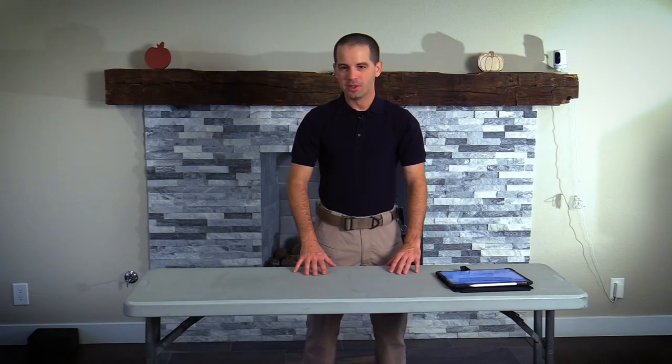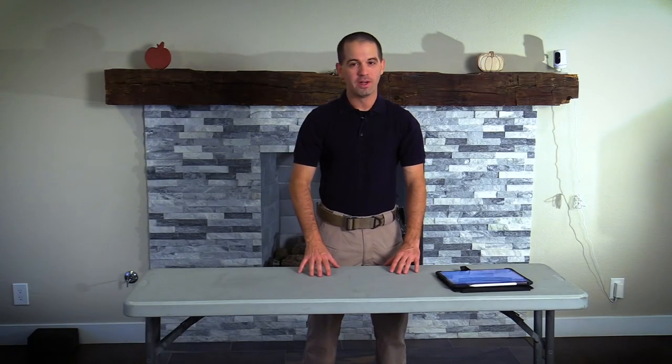Hello Internet, Sam Scheller from EMS Field Training, and today we're talking about video laryngoscopy with the Clearview Video Laryngoscope.